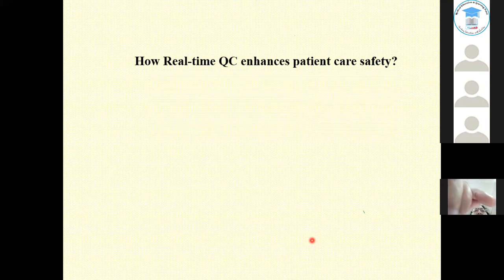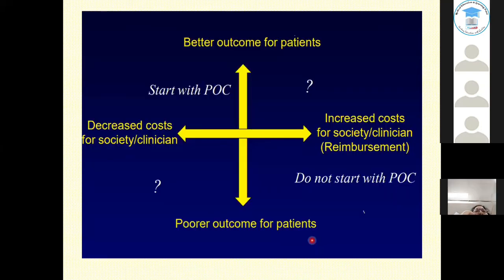So instead of your 8-hour QC process, what you have is your QC being run every time a sample is run, and then more extensive checks every 4 hours, and even more extensive checks of cartridges, etc., every 8 hours. So that is how a real-time QC works.